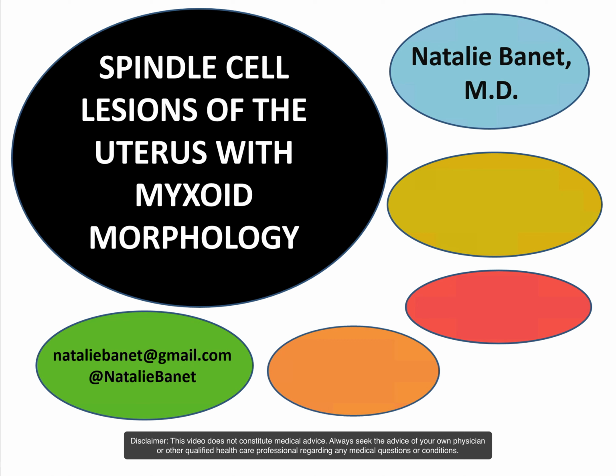So this is one of my first attempts, so I'm going to record this lecture that I gave at a departmental meeting maybe 6 months ago, though time is a continuous circle and I honestly don't remember. But it's a case which I turned into a differential diagnosis presentation on spindle-celled lesions of the uterus with myxoid morphology. And just as a brief background, my training is in GYN and cytopathology. So GYN pathology is a great love of mine, and I hope you find this helpful.